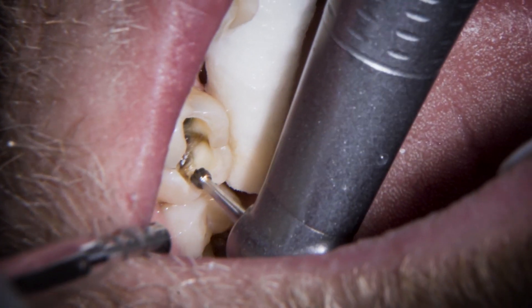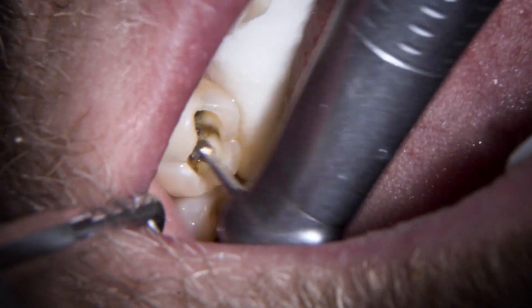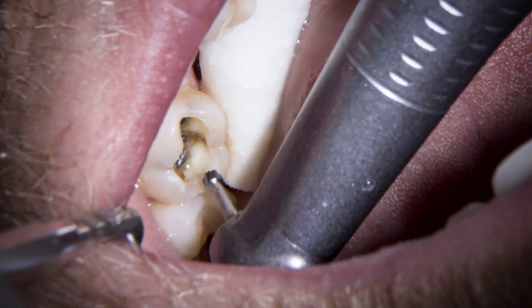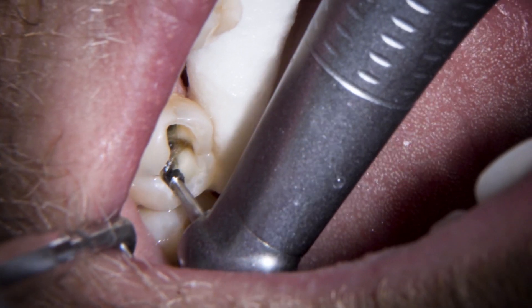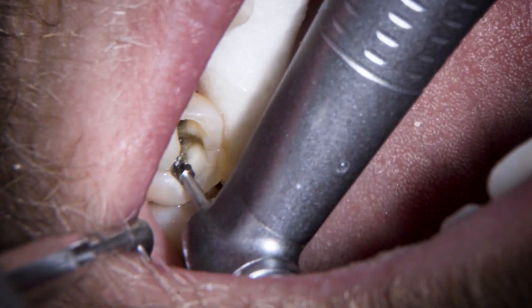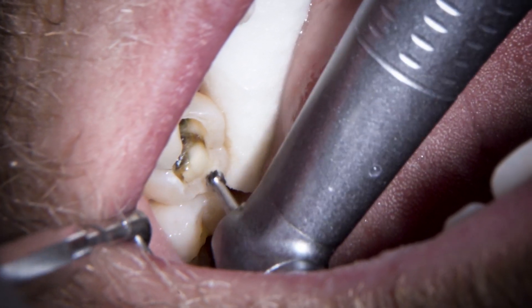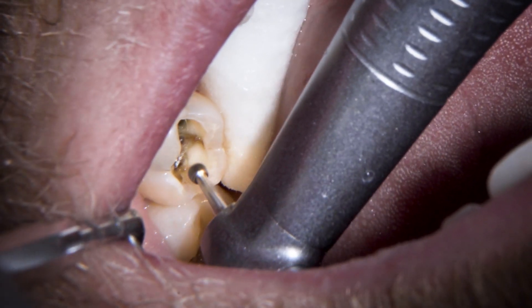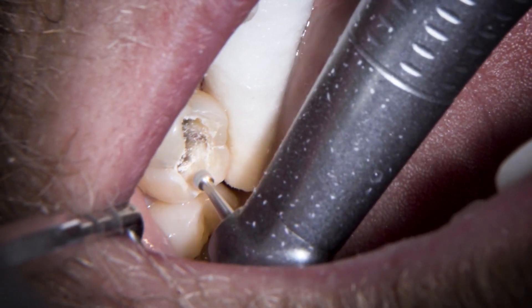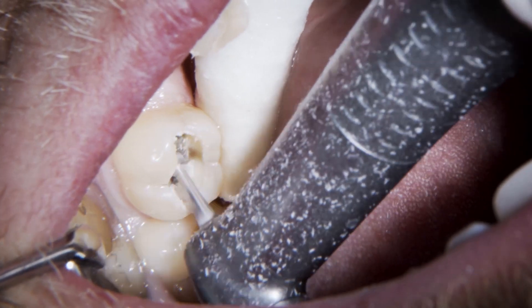In this distal area we'll often find that can go through all the way to almost a little distal cavity. I don't think it is going to in this case, but if it was, using biodentine I'd always try to maintain the marginal ridge — not necessarily a tunnel prep, but clear that all out. Knowing I've got biodentine in there means that cavity won't be able to progress from that outer surface. Almost like the old-style tunnel preps — if it had gone almost to the surface of the enamel I would try to keep that intact and just get the biodentine in there.